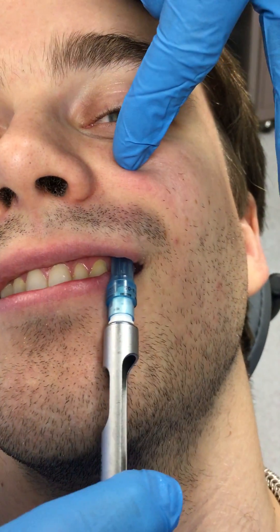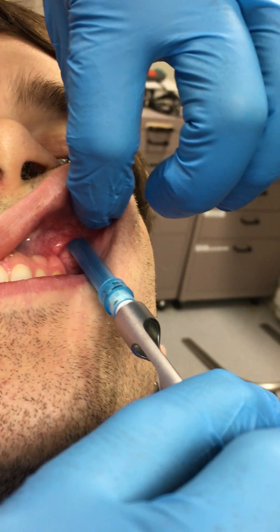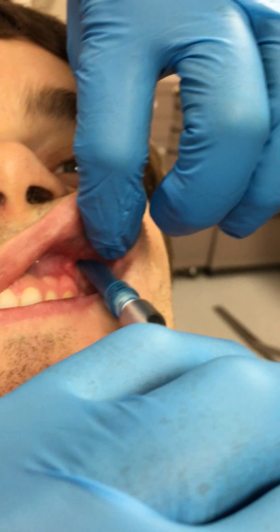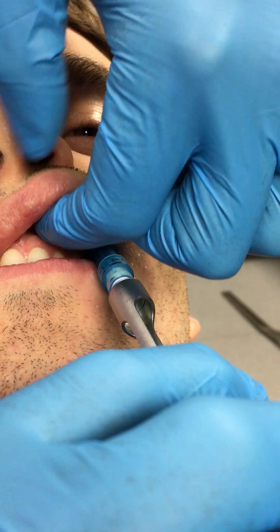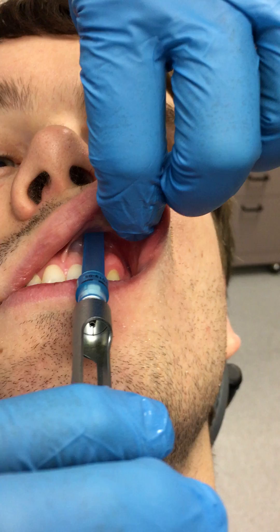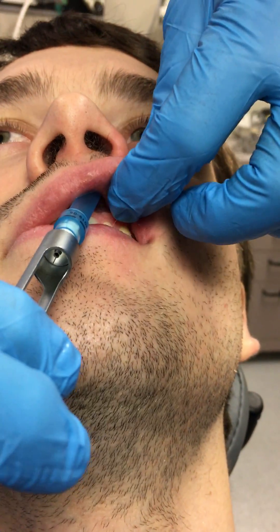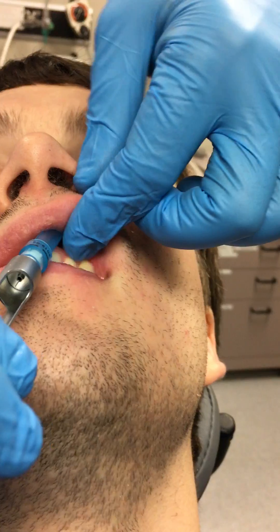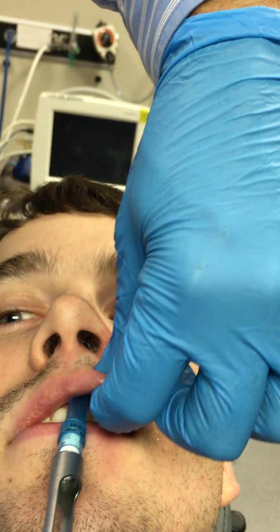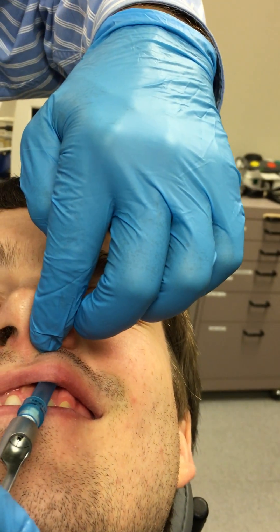If you're giving an infiltration, I just wouldn't be pushing up in the vestibule so much. I would just be injecting — look at the angle — now I'm angling towards bone and I'm pressing on bone. That's exactly where I'd be injecting. And as you come across the anterior, if you wind up injecting too high, you're going to be in the nasal floor. But all I'm showing you is that depending on how tall a person's maxilla is, you could be right there.